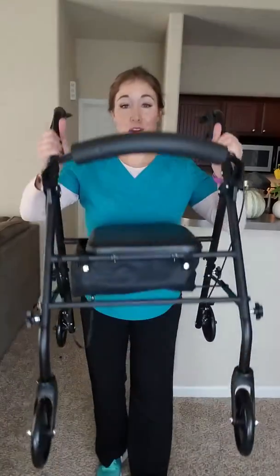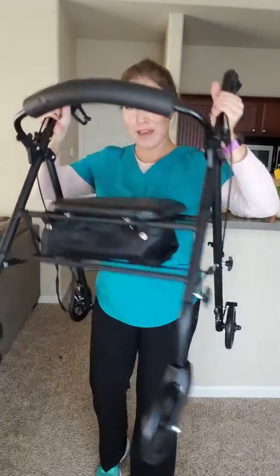Just to show you what I'm talking about, it's the one with the four wheels, front and back, and then the handbrakes, and the seat, and the basket. So that is from now on what I'm going to call a four-wheeled walker, and this one in particular I got from Walmart from the pharmacy section.